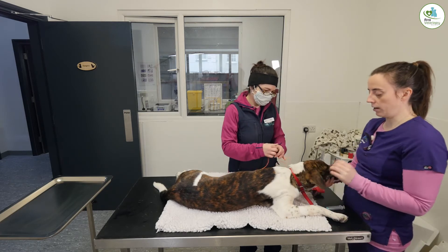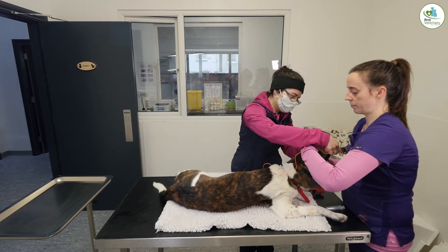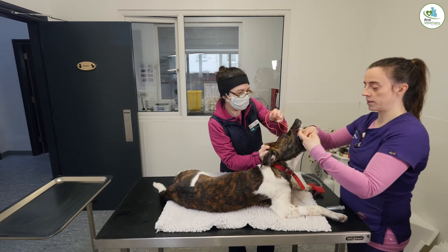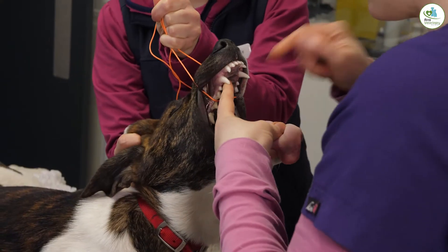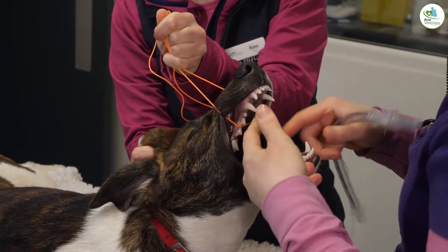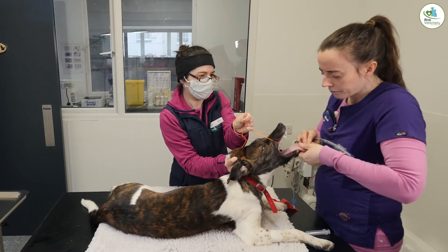When you place the ET tube it's always useful to have someone give you a hand, so Anya is going to hold him in position. A useful tip if you are by yourself is to hold it in a position like this with your thumb in like that, so you can manage it yourself — sometimes you might have to do that in an emergency situation. But Anya has it held up here nicely.